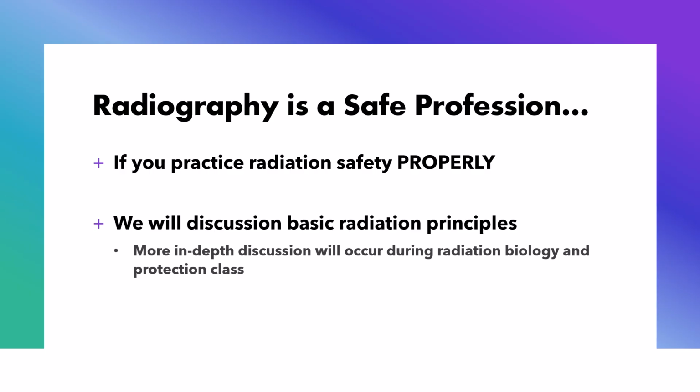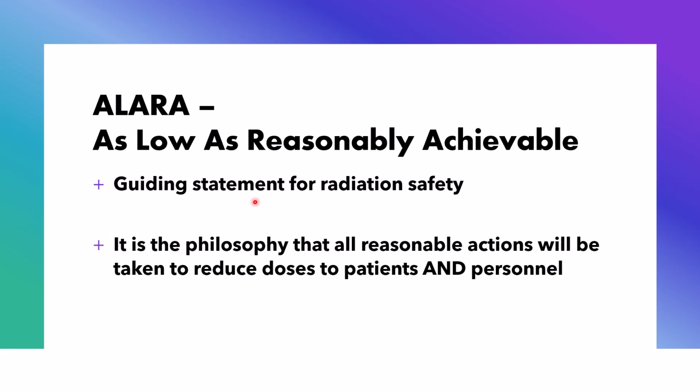Radiation safety, if we're talking about that: our x-ray profession is not harmful to you if you practice radiation safety properly. We will discuss basic principles here shortly. We go by the rule of ALARA, and every X-ray tech should know this. It stands for as low as reasonably achievable.